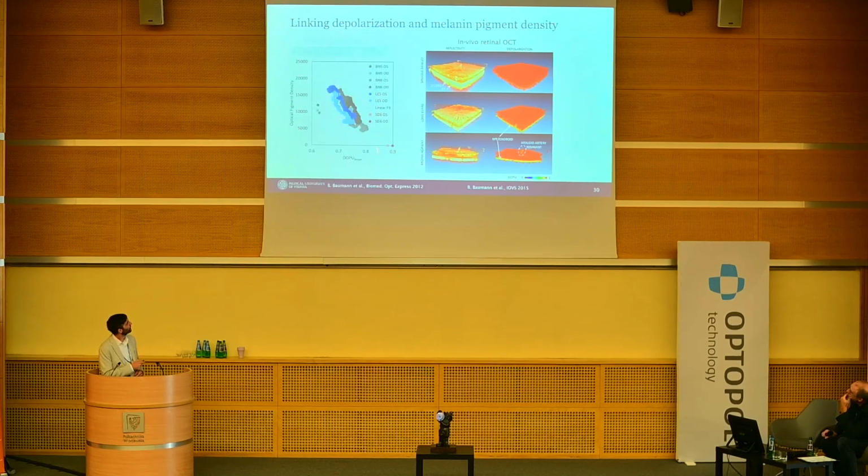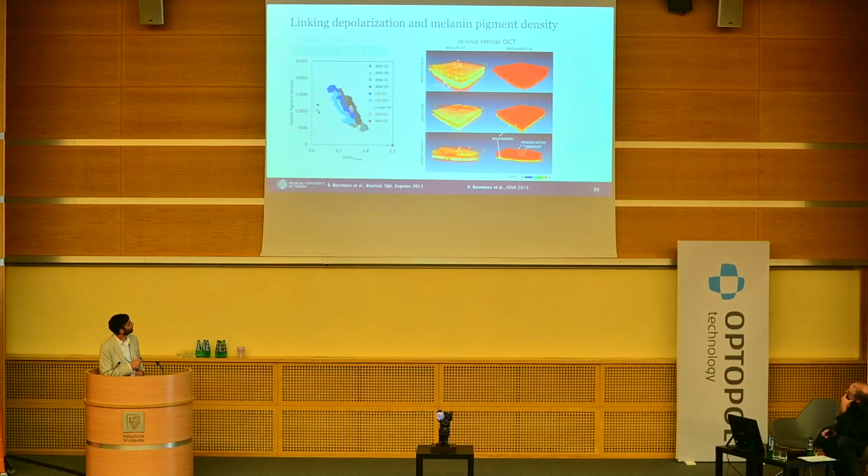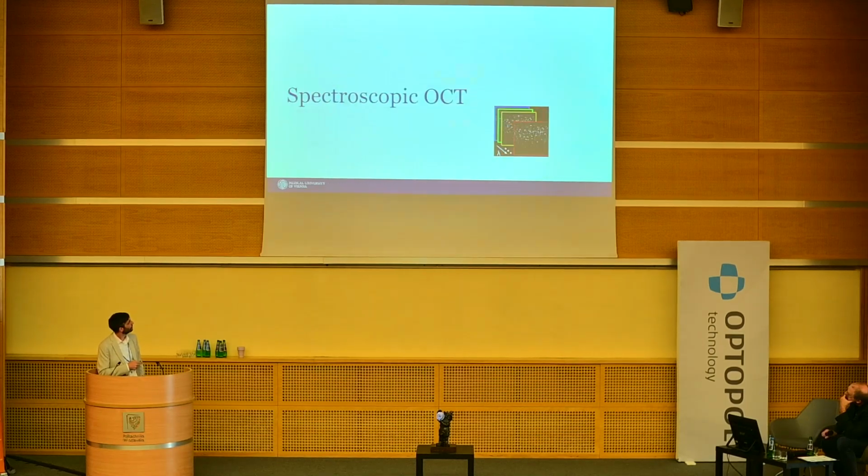And because there's a quite nice correlation, we think this could be a quite good parameter for non-invasively assessing the pigment density in situ and in vivo.